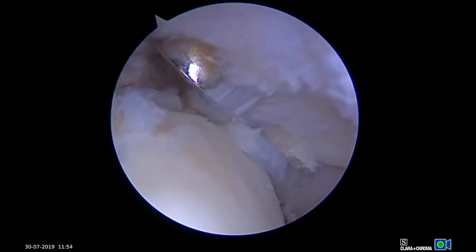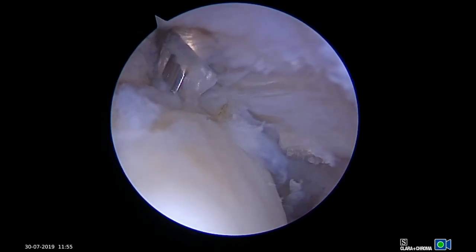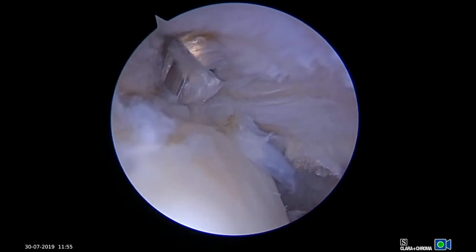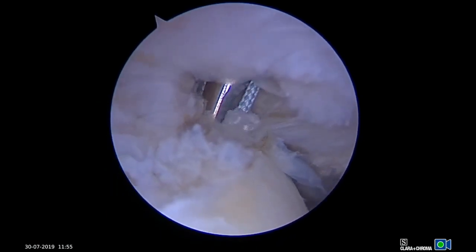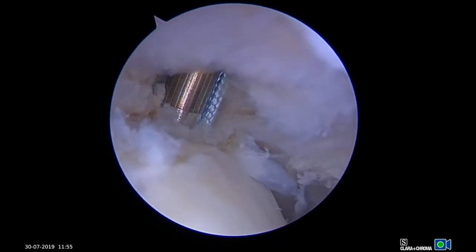A double-loaded anchor is placed through a 5.5mm metal cannula under direct visualization at the edge of the articular surface. The metal cannula is small enough to easily fit through the bursal split but rigid enough to allow for accurate anchor placement.